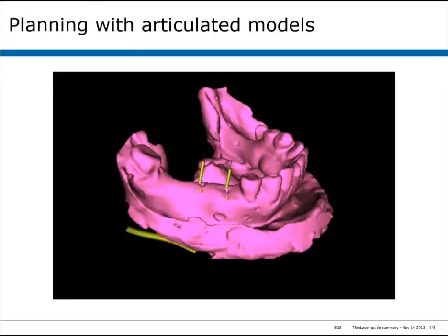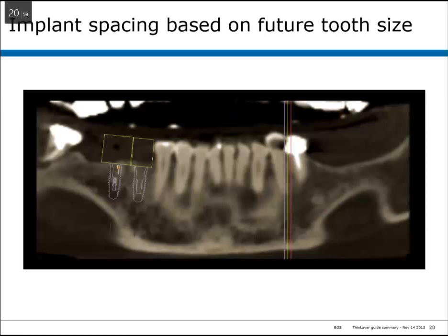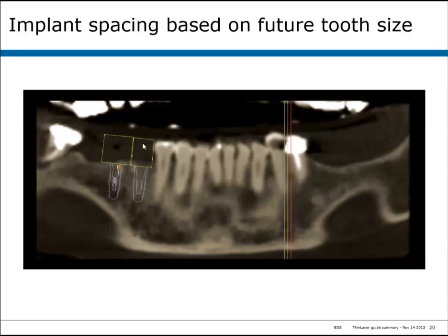In this first situation, this illustrates planning with articulated models. Initially, the implant is placed in line with the first bicuspid, and a virtual abutment 7 millimeters in diameter is placed, which approximates the size of a bicuspid tooth. By placing the mesial of this abutment on the distal of the adjacent tooth, the spacing between the implant and the tooth is perfect — based upon the future tooth size.